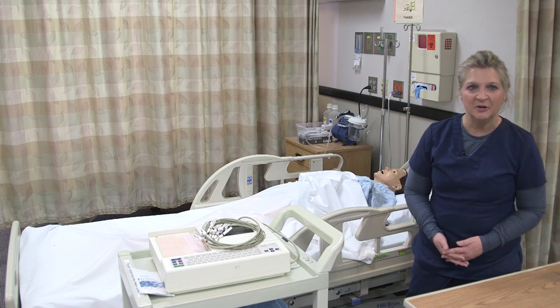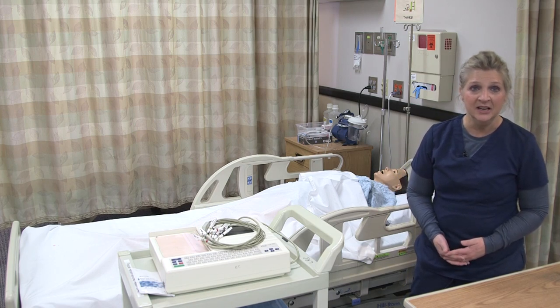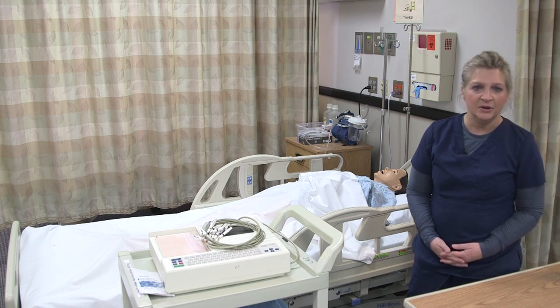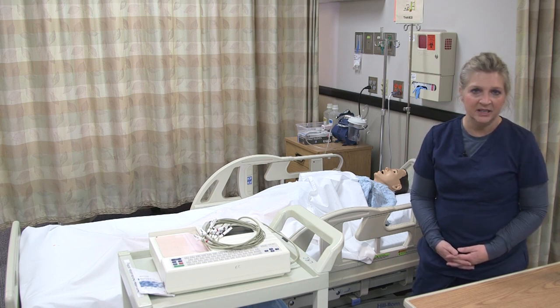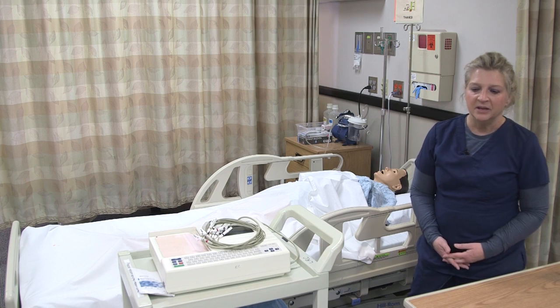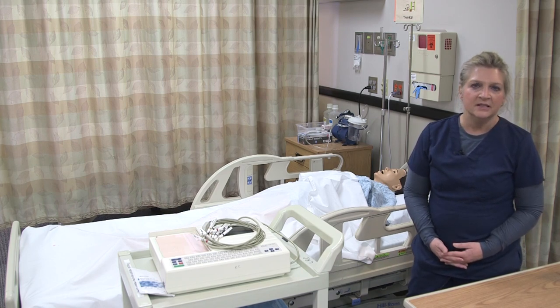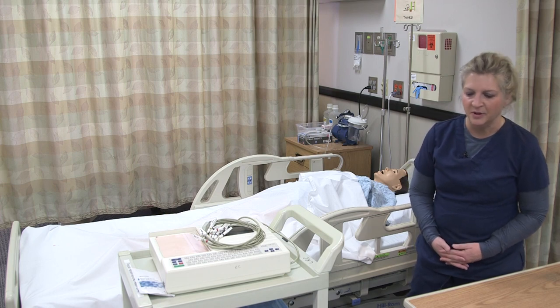So here we are. We're going to be performing a 12-lead EKG on our patient. We verify the order or the prescription for the 12-lead EKG. We just make sure we want to double check the patient's medical history, to confirm that this is indicated for the patient.